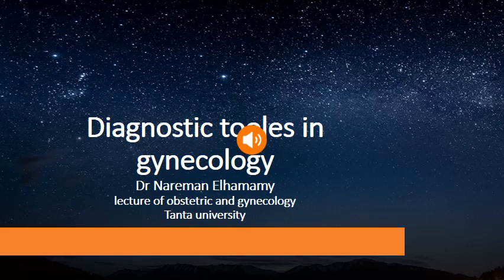This is a picture of polycystic ovary. The picture shows multicystic ovaries, not a single cyst. It's called polycystic ovary disease. This picture shows the molar pregnancy. Molar pregnancy means the uterus is full of vesicles.